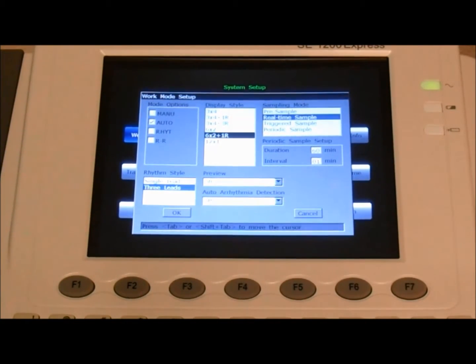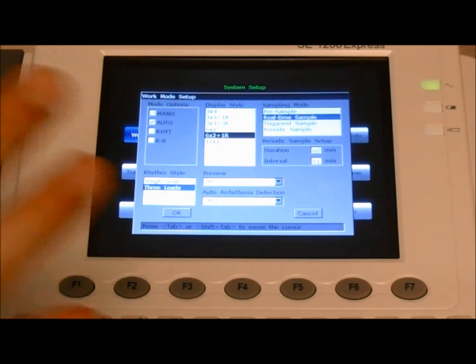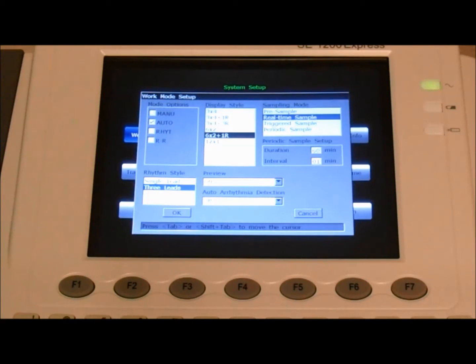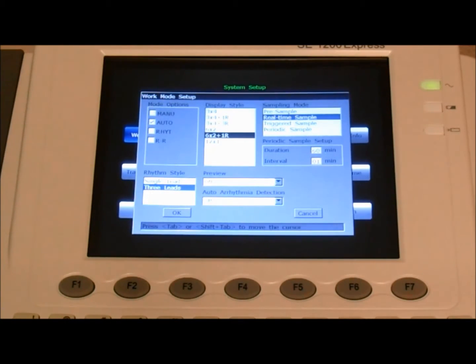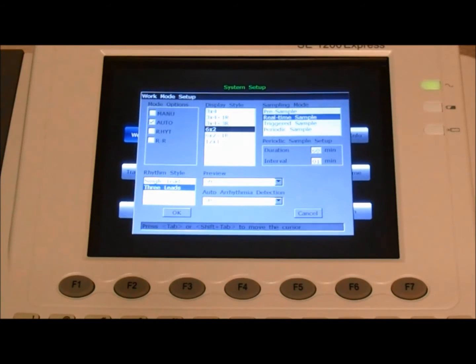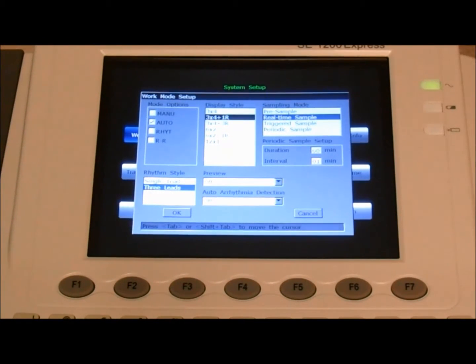Display style, this is how we set or control how the information or the leads are displayed on the screen. We'll set it to three by four plus one, so three leads by four plus one rhythm.